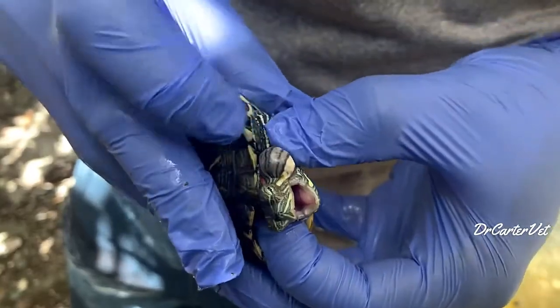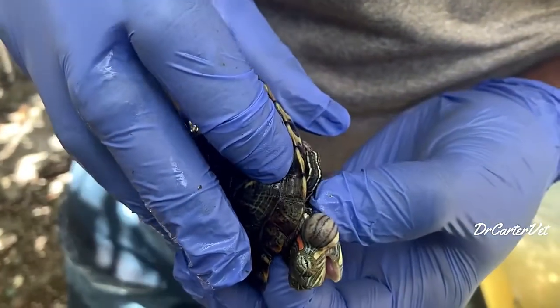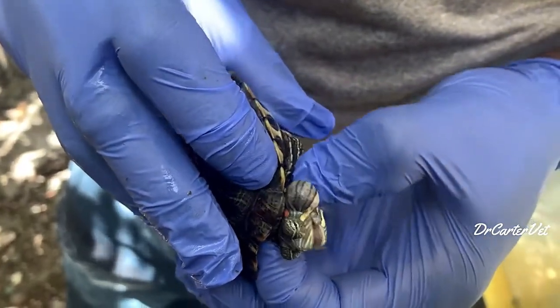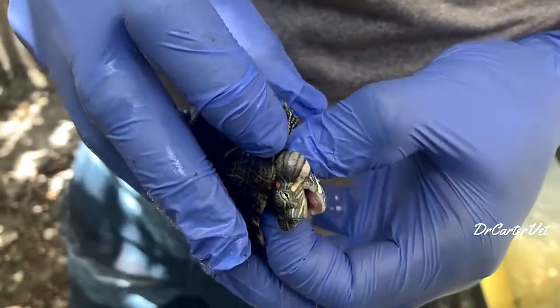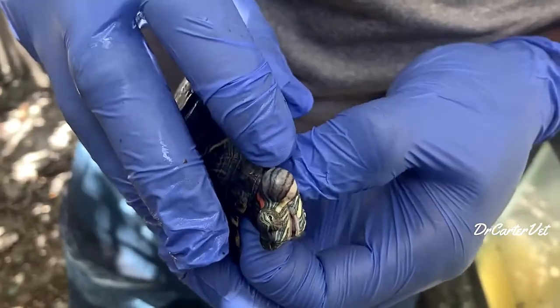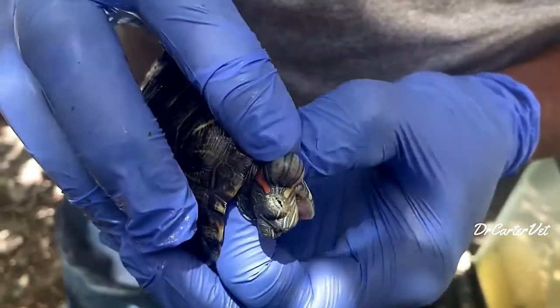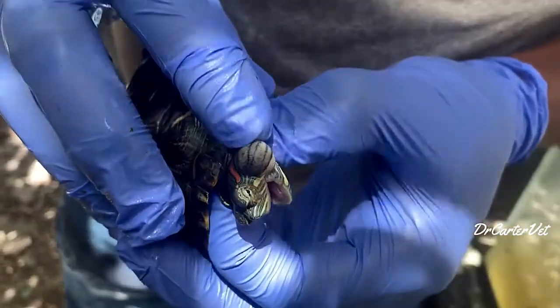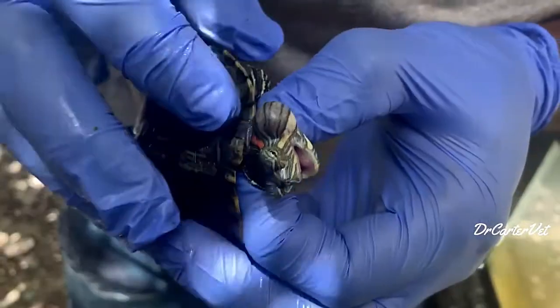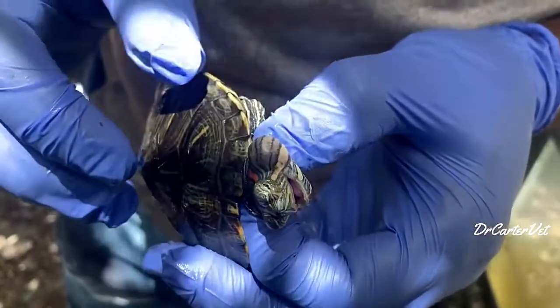So if you're looking at this and you're a veterinarian, or you're somewhere outside of the access of a veterinarian, and you may have to remove one of these from a turtle to save its life, to help it grow, to increase its quality of life — this is how you can do it. Have a listen.